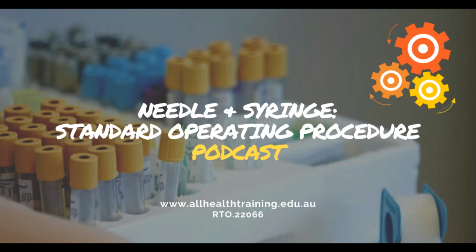Warn your patient there might be a sharp sting. Insert the needle and ground the back of your fingers against the arm for stability. You should see a flash of blood in the hub of the needle if you are in the vein. Gently pull back the plunger. When you have established the blood flow, loosen the tourniquet. Use this time to look up at your patient and ensure that they are okay.